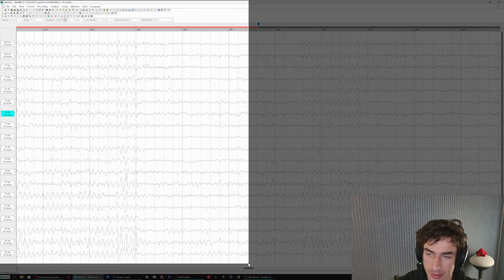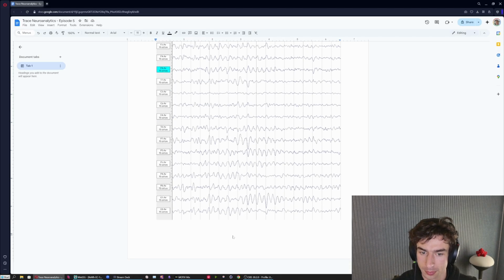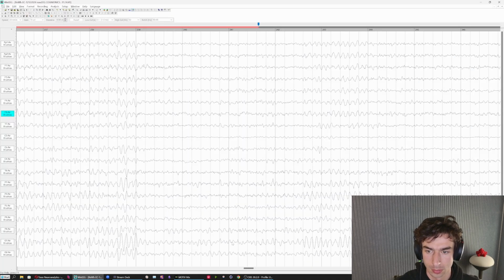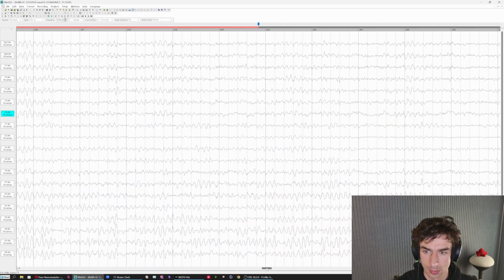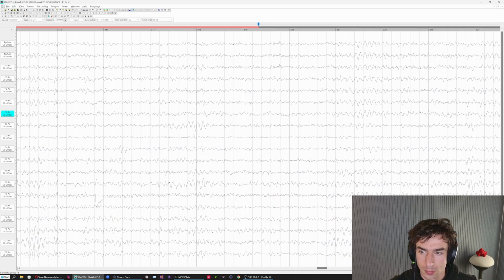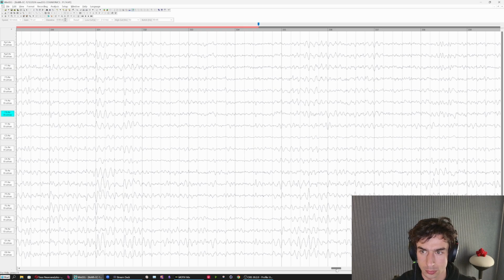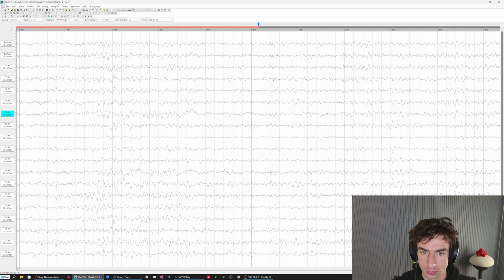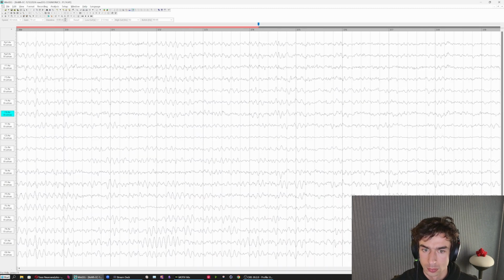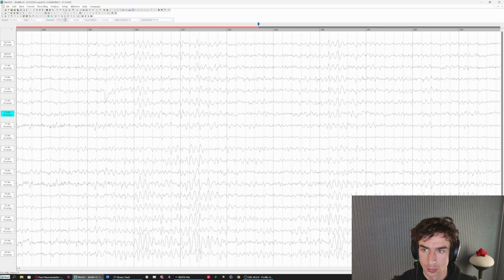This is an alpha dropout that's associated with drowsing. Little electrode pop here at FZ.